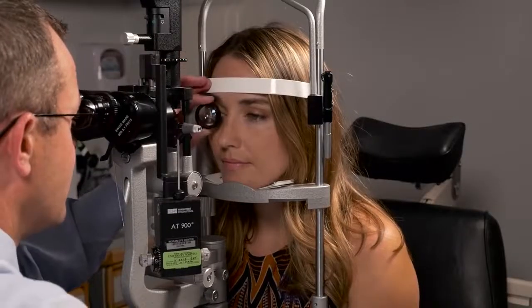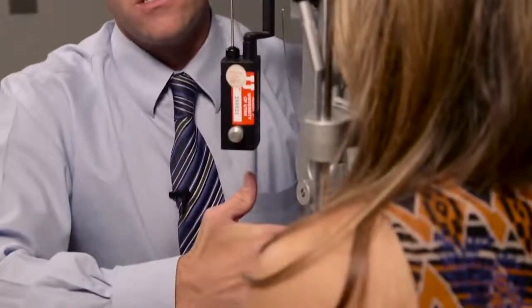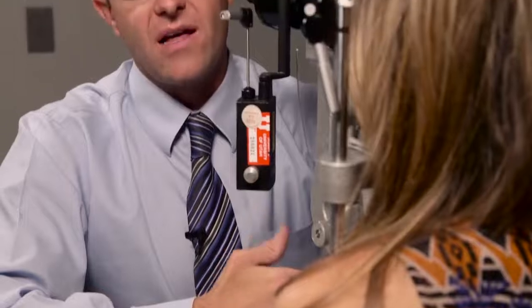So we focused in on the nerve of the eye, and after seeing the nerve and looking at the blood vessels, you are going to pull towards the patient's nose, all right? And that will shift the beam over towards the macula. The macula and the fovea are the high-priced real estate. That's where the majority of vision occurs and where the majority of retinal diseases have their source.